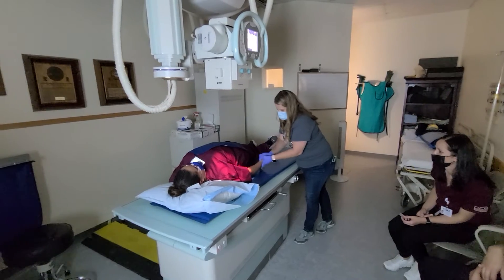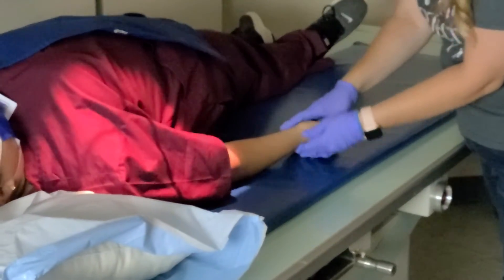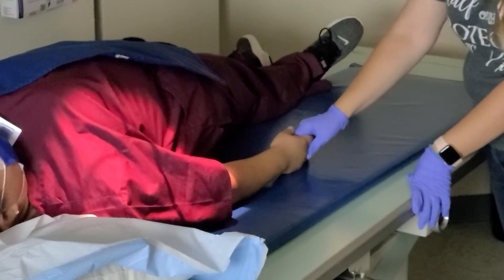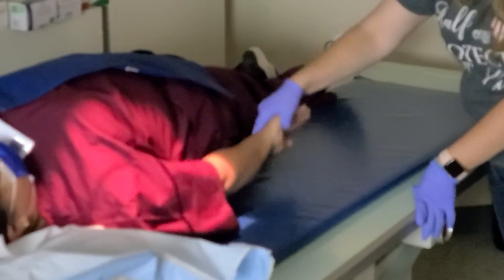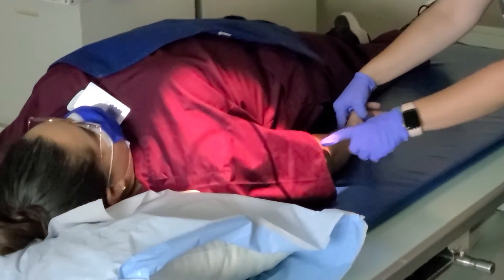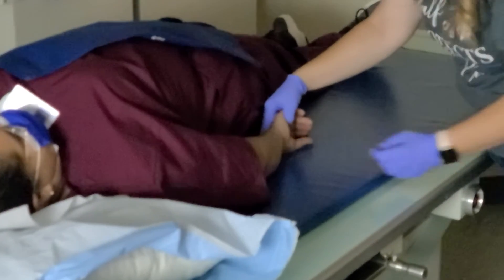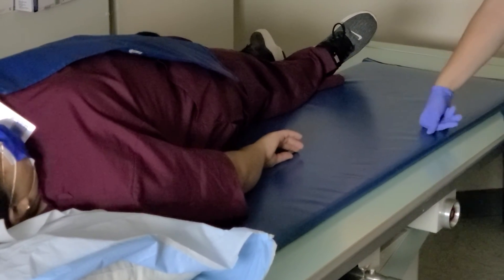When you rotate it again — people always want to just do thumb down directly, but your arm doesn't turn that way. So go palm up, thumb in, then thumb down, and it gets there. Some people can't keep their arms straight, so you may have to put a slight bend in it to let them get into that position.